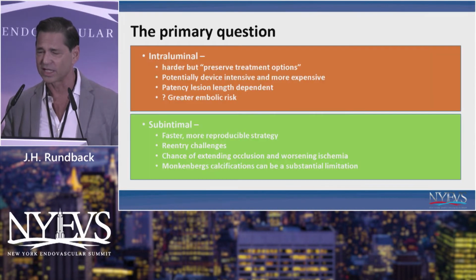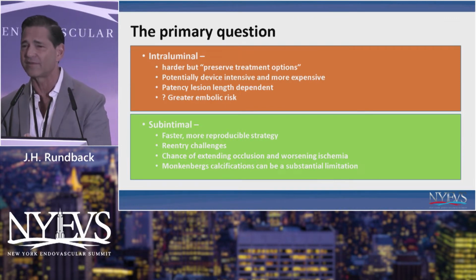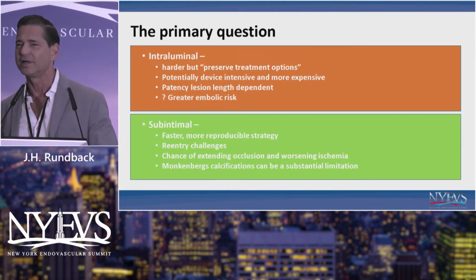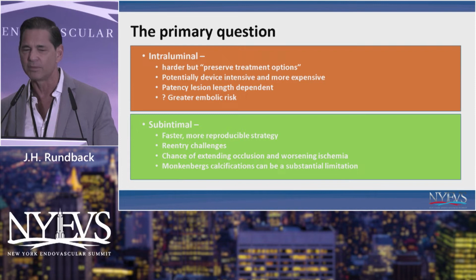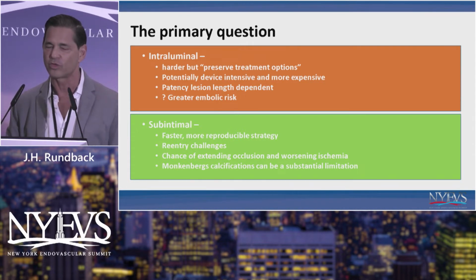So, clearly these things have a role, but let's go back to the primary question, and I've given this talk a number of times. When you're treating femoral popliteal CTOs, do you need to be intraluminal or subintimal? And if you ponder this, I'm sure you've all done both, right? And you take it as the case allows, but there is some science behind this, and I'll show you some cases as well, how we go through this evolution.